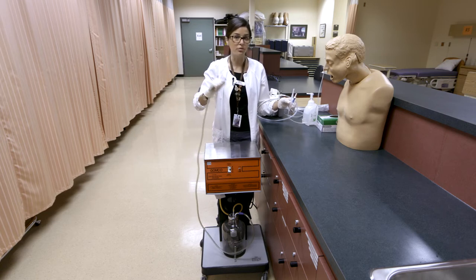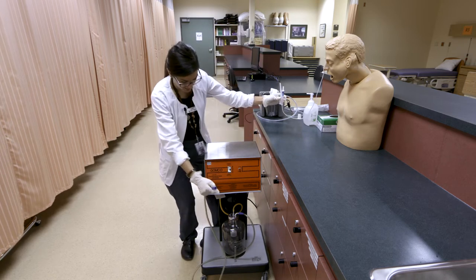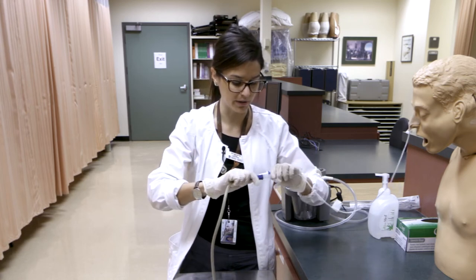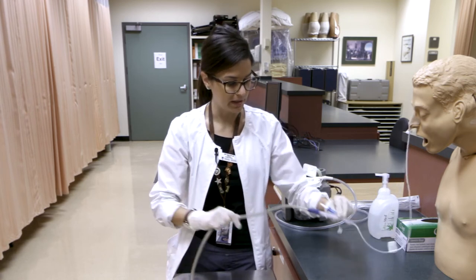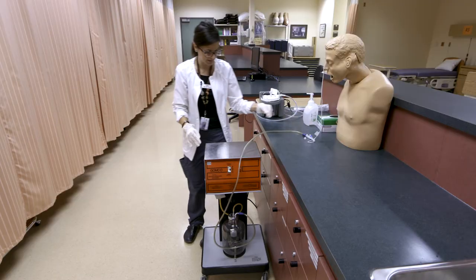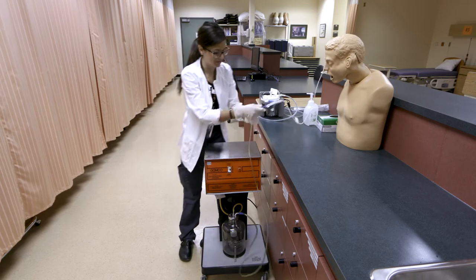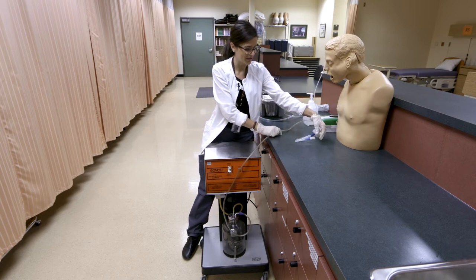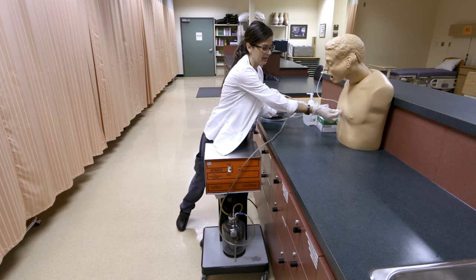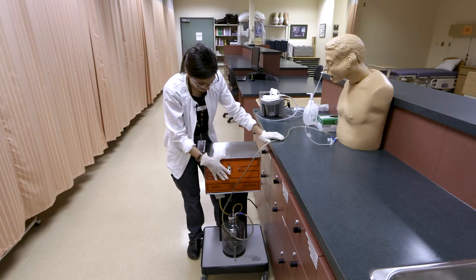This is suction tubing — the same tubing used for Yankauer or oral suctioning — that hooks up to the suction device and the canister. We're going to hook it up to our connector piece, make it comfortable for the patient so it won't easily detach. We attach the tubing to the patient's gown with a clothespin here, so it won't flop around.